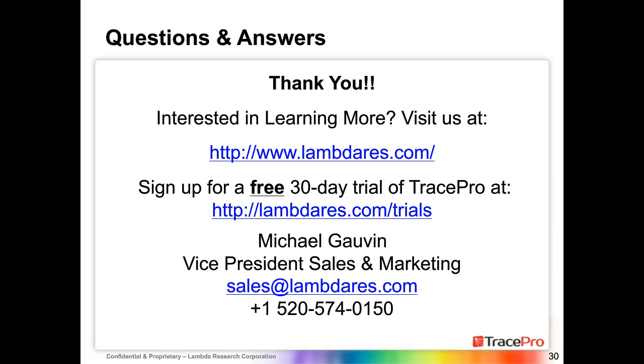Okay. Next question. Are there more off-the-shelf biosensors out there besides MAXIM's and OSRAM's? Yeah, there's one out there from Philips. I believe Masimo has one. Doing a web search should probably help you out there, but yes, there are more out there. And I'm pretty sure there's more coming every day, because as we see, if people start getting into wearables and wanting heart rate monitoring with oxygenation, it's going to be huge.